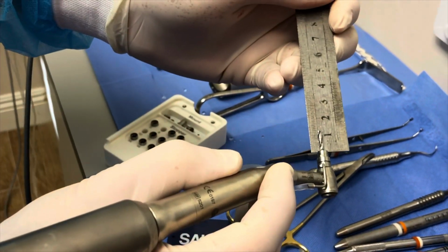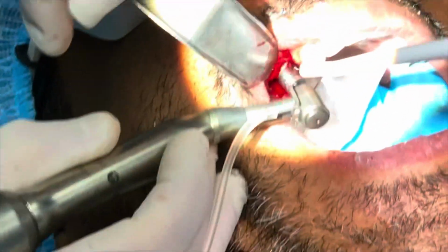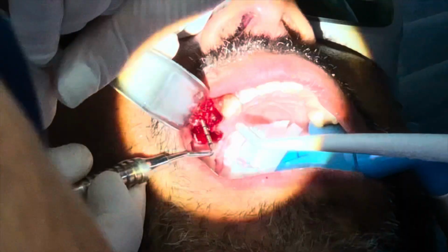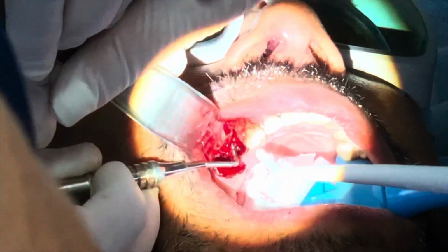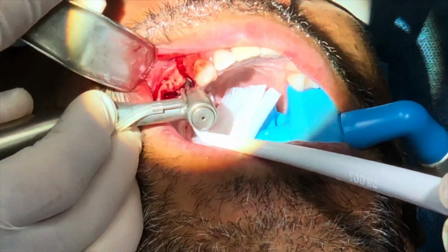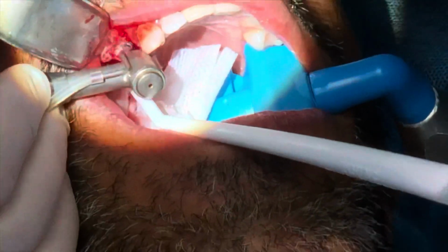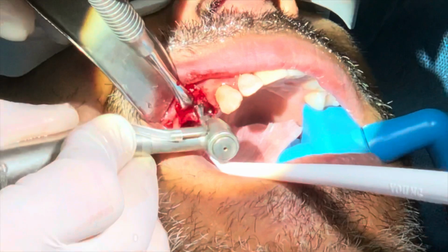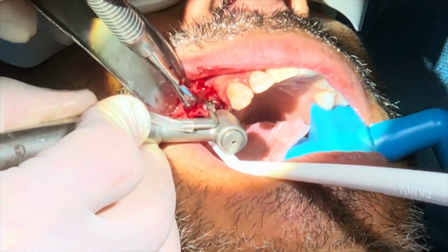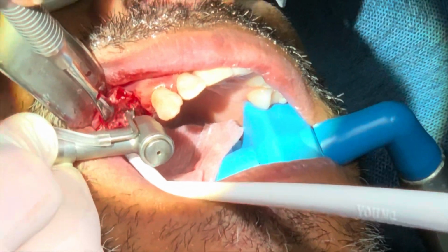I use a pilot drill with a stop system I got from Salvin's, set at 12 millimeters. Of course, with the prior CBCT study, I have determined that I'm going to use a 10 millimeter implant. I just want to go a little deeper with my pilot drill to be able to insert the full length of my implant. I enter the bone at an approximate 8-degree angle.